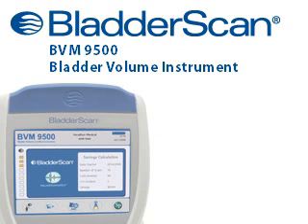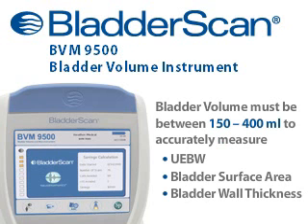To measure UEBW, the patient's bladder volume must be between 150 and 400 mL. Within this range, UEBW, bladder surface area, and bladder wall thickness will automatically be calculated.